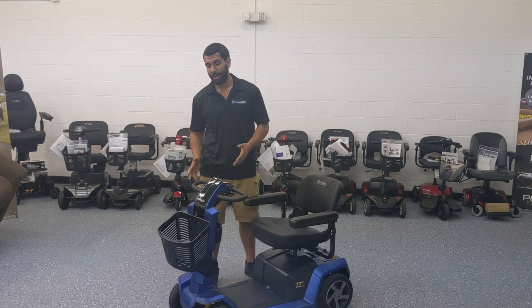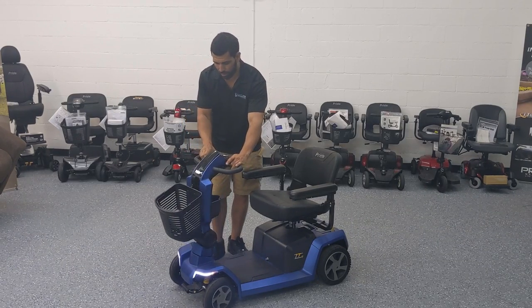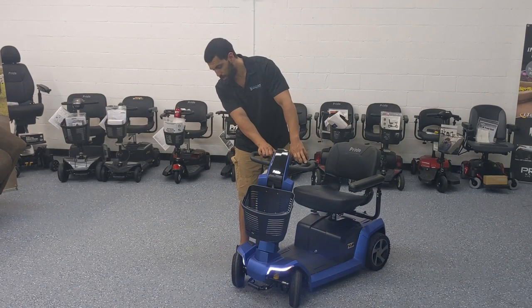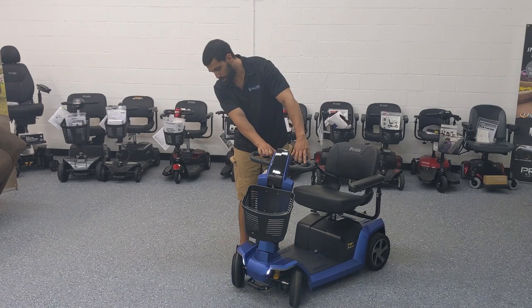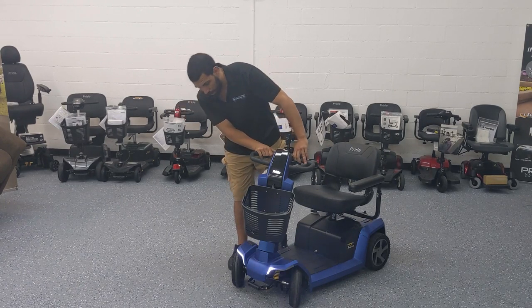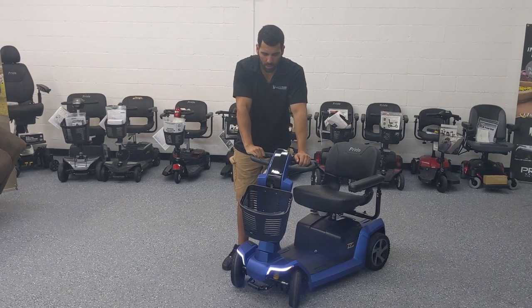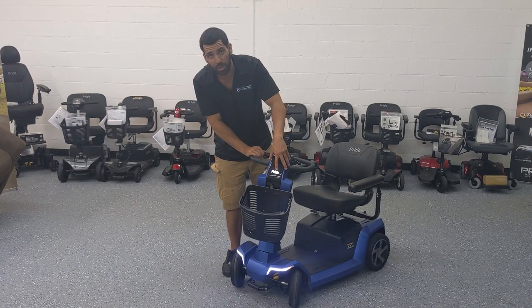You'll notice it has a pretty impressive lighting package. It actually has turn signals — you can see the right turn signal blinking when you signal right, and the same for the left. I haven't seen any other scooters with this type of LED lighting; it's very similar to a sports car. A lot of our customers love it. And of course the Pride insignia logo is also lit up — it looks great.